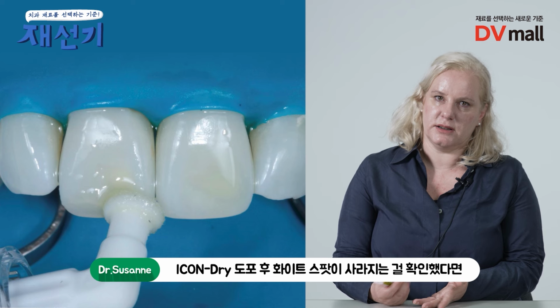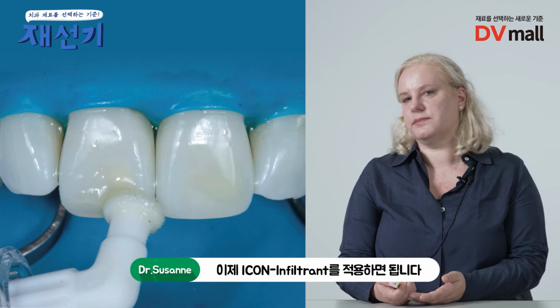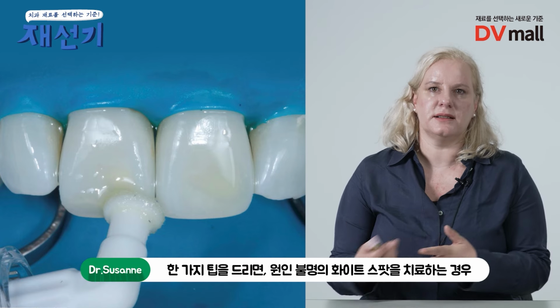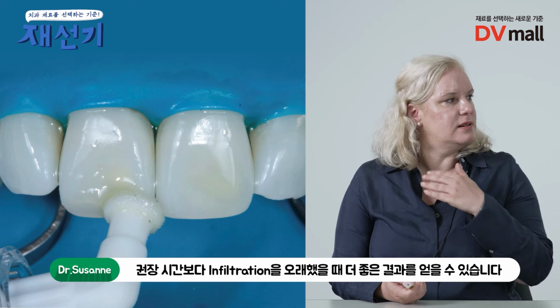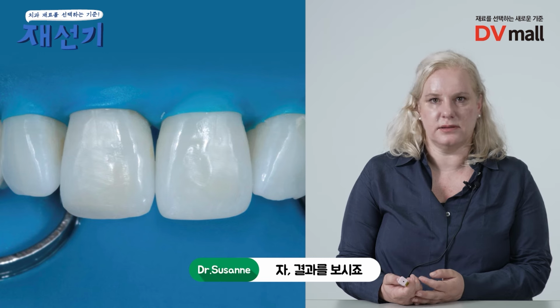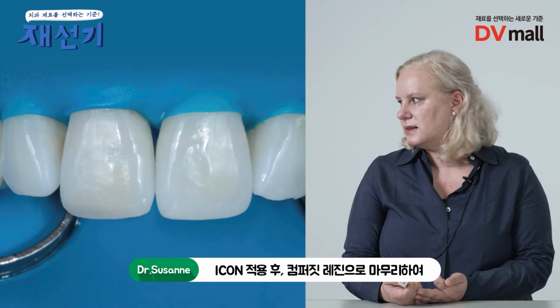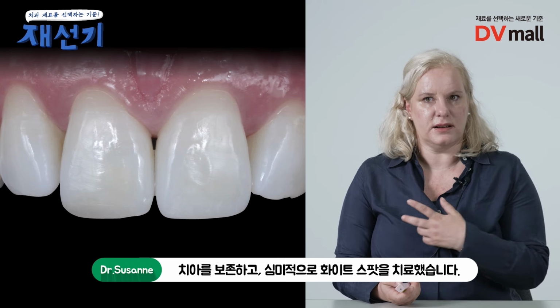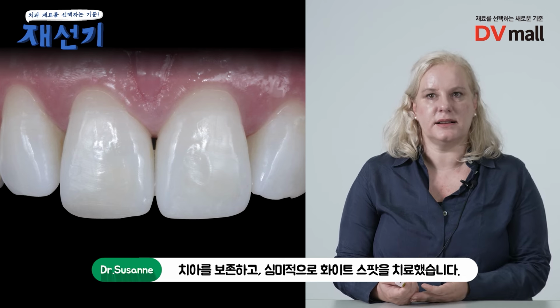And at this stage, we decided to perform the infiltration according to the protocol, but in lesions where you do not necessarily know for sure what their origin is, it's also a very good idea to give a little bit more time for the infiltration. Here we see the final result after the infiltration, and also the application of some composite layer, which I think is a very minimal invasive tissue saving procedure that really gives you a nice clinical result.